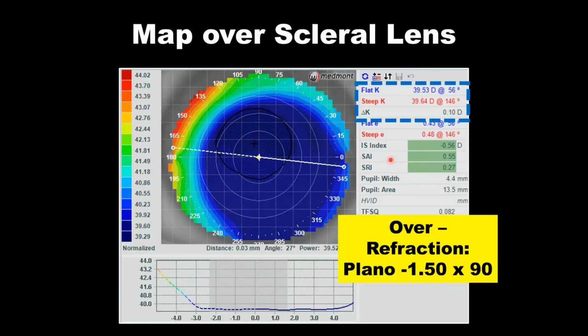Related to scleral lenses, it's not uncommon that we have some odd over-refractions, and we may have to pick up cylinder and add it to the front of our scleral lenses. The study that we did at Pacific U showed that about 15% of our scleral patients require front toric optics. So a pretty big percentage of our scleral patients may need a lens that sits on axis, that can't rotate, so we can provide that spherocylinder refraction on the front.